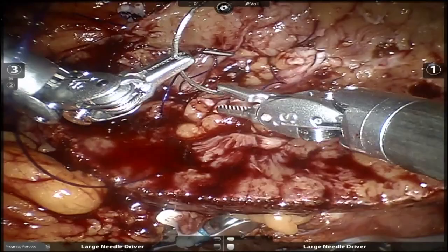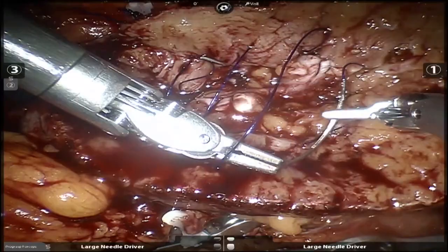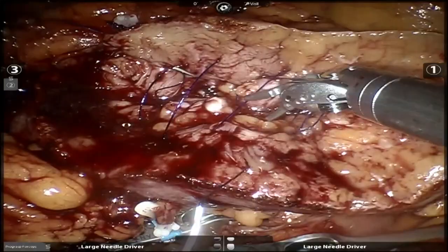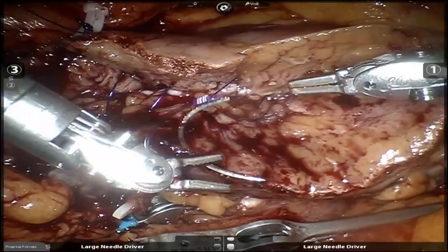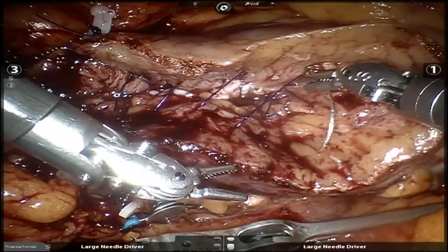All right. Brandon, please be quiet. So you make three layers of sutures, basically. Yes, exactly, Gunter. But not if you don't enter the sinus, right? Then you just do two. Oh, but it looks very nice. I'm having a hard time with these needle drivers today. They just don't want to.